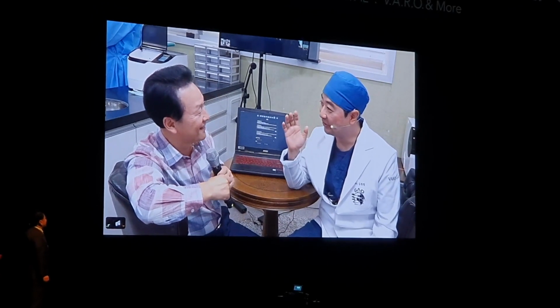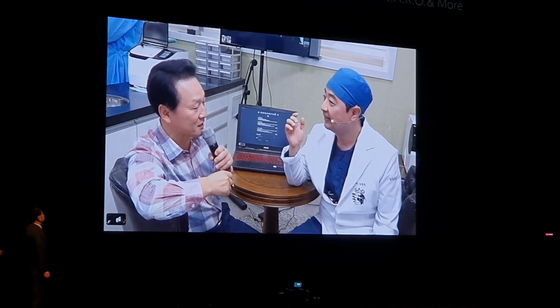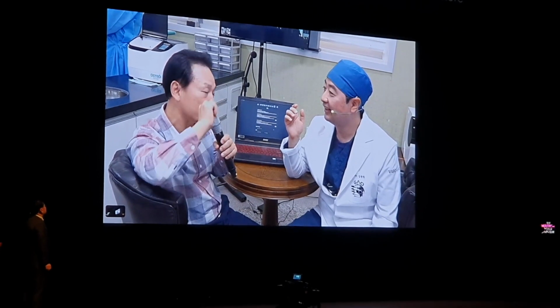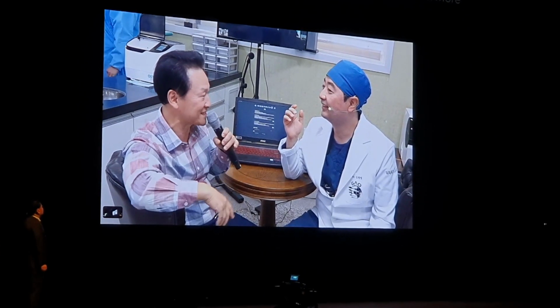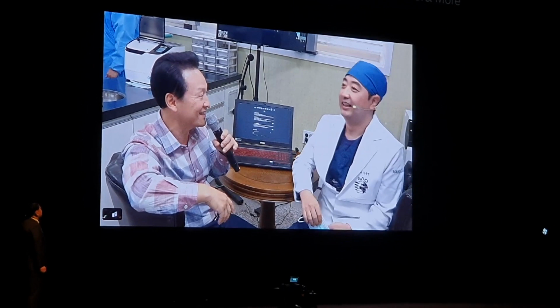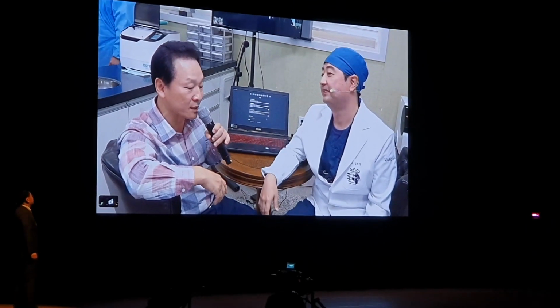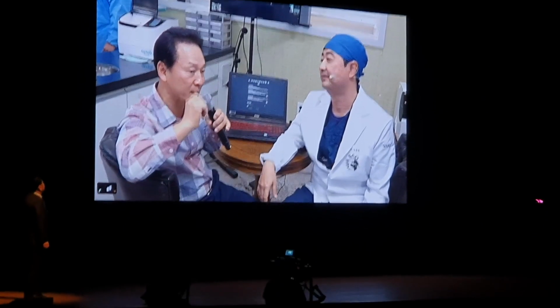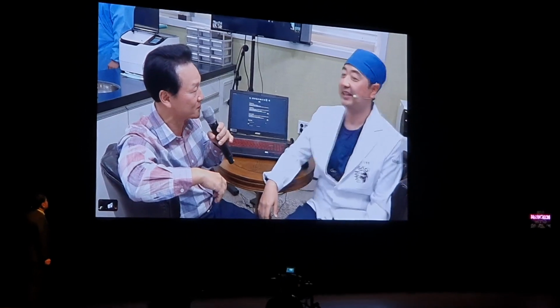If and when you need me at any time, I'll be right there. Then I go as far as I can, and if anything goes wrong, I'll hand it over to you. Sounds good? Well, let's see how it goes. Though I've never done this before, I'll trust the guide, so please be present beside me.